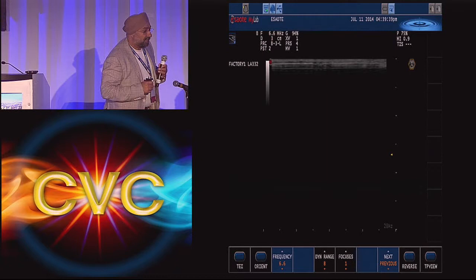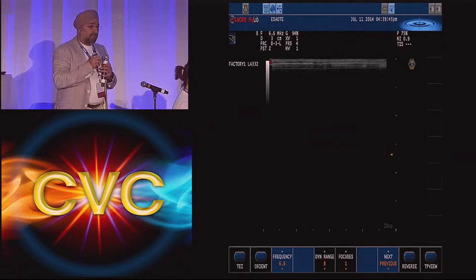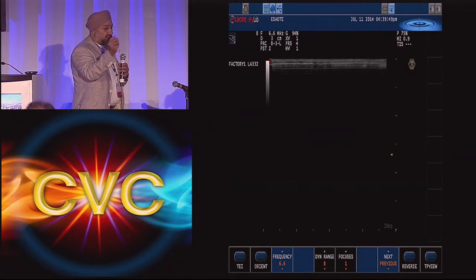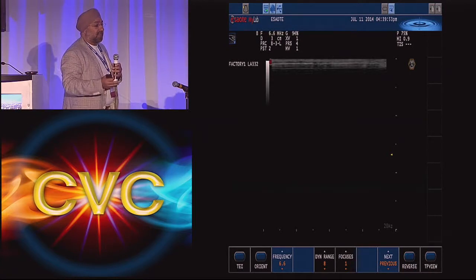Say it again, please. How far do you go out of the knee with the laser, at the knee area? Yeah, so I'll go up to the point of where the reflux is. Like how many centimeters? I mean, just past the branch, wherever that is. I try not to ablate the normal vessel.